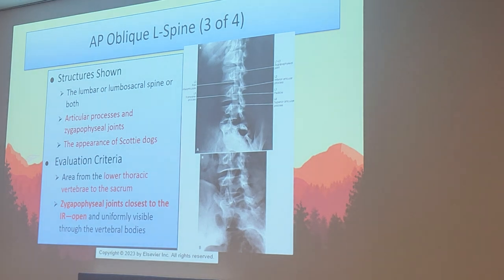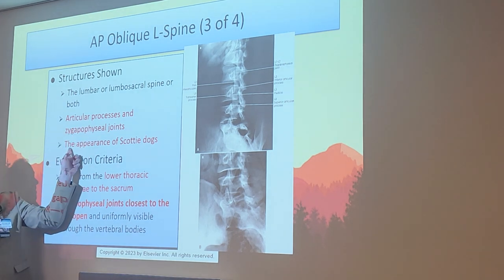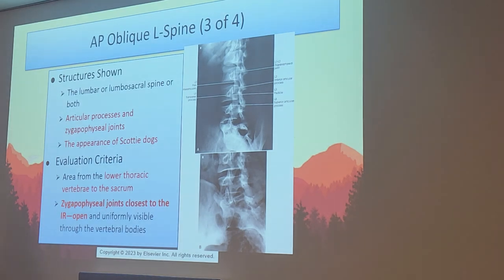What are we looking at, guys? Of course, the big star of our show on the obliques are these two things right here, the zygapophyseals and the Scotty dogs. That's our two big stars of our show, but we're also going to include what we call the articular processes. And what do we want to see? The area from the lower thoracic all the way down to the sacrum, which is, once again, why, in my opinion, you would never use a 10x12. Even though you can technically get on there, you're going to be cutting it really close. Use your 14x17 to make sure you're including that entire area.